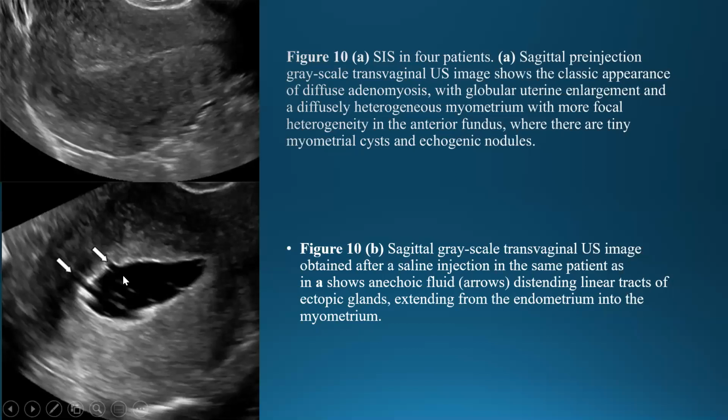It's very cool. Although it's a saline infusion sonography, as I mentioned, it's not the primary tool to diagnose adenomyosis, but if you are desperate and you don't have any other clue, you could use it. It might give you a better picture and a better idea about what's going on.